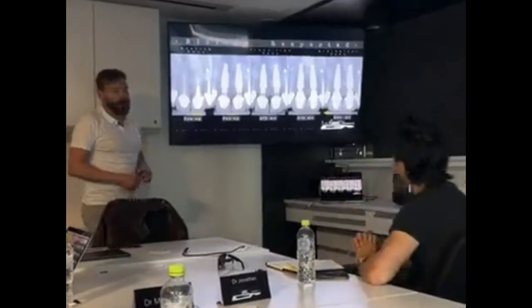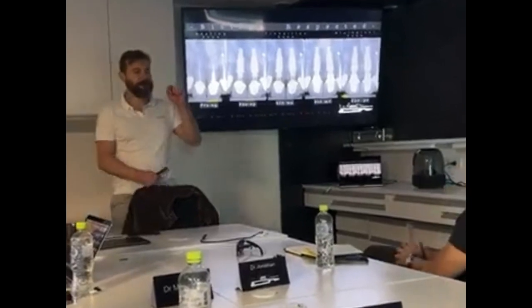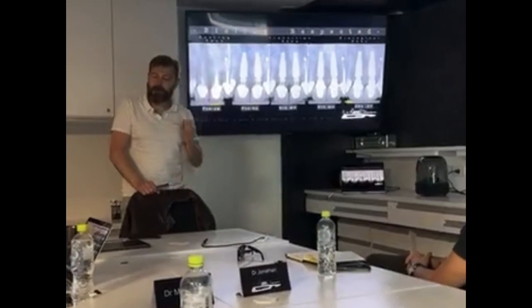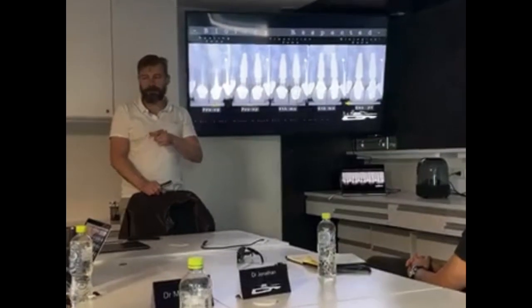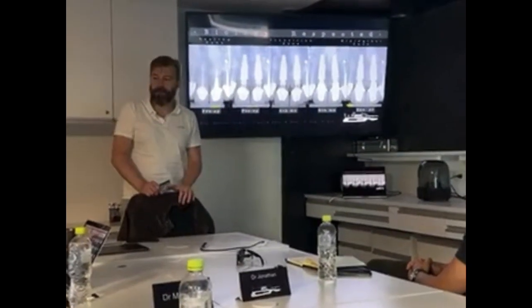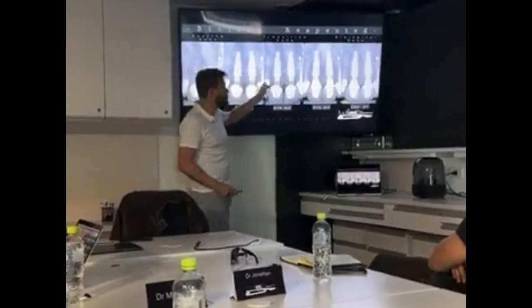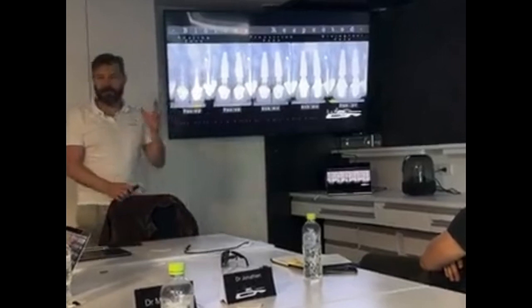Beautiful. So what is the idea? We understand first about how to preserve the tissue, how to do the design of the provisional, how the abutment can influence the tissue formation, about how to graft inside, how to position the biomaterial. So if you take this chance to preserve the tissue in the best way, the idea is to really have inside the socket a very strong peri-implant tissue.